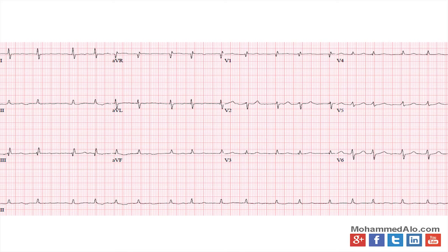If a patient comes in like this and previously had a pretty normal looking EKG with normal voltage, what do you want to worry about? Something that's causing the heart to not conduct very well. There's only two things really that do that: either fluid around the heart or air around the heart. Could have a pneumothorax, could have worsening COPD, could have a pericardial effusion. So watch out about those.